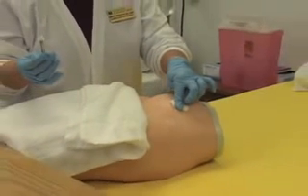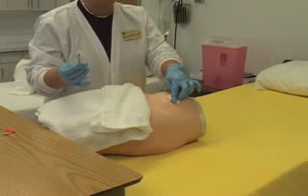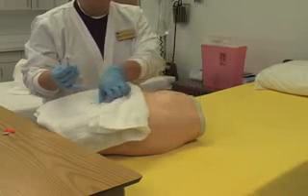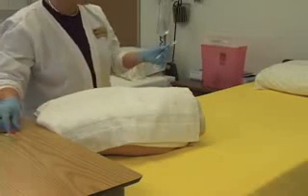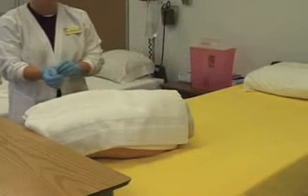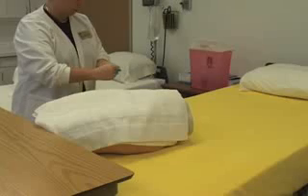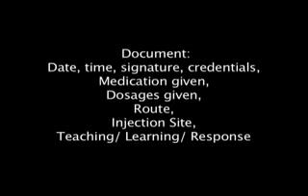Apply gentle pressure to the injection site with an alcohol wipe or gauze pad. Do not recap the used needle. Activate the safety shield. Discard the needle and syringe in the sharps container. Perform hand hygiene and document. Documentation would include date, time, signature, credentials, medications given, dosages given, route, injection site, and teaching learning response.